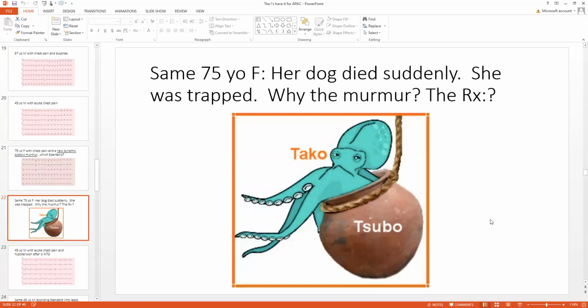The base of the heart will contract, but when it contracts, the apex and the anterior and inferior walls will bulge.